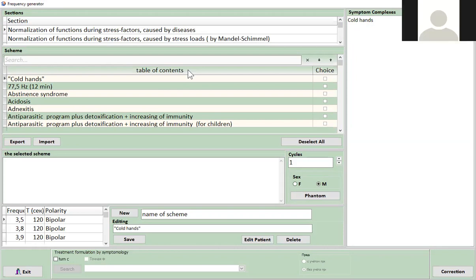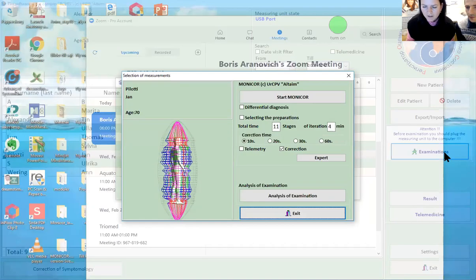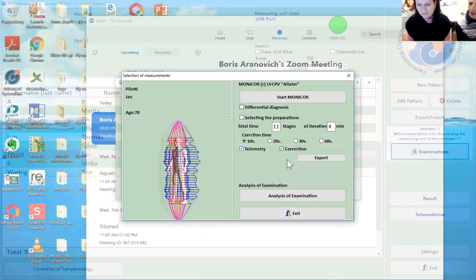On the previous page, what does telemetry mean? Go back again to the page before, Victoria. Which one? Examination, yeah, this one. Yes, you can choose correction and then telemetry. I think it's something that was used before also. You can send the result to another computer, and many people can have the same result.